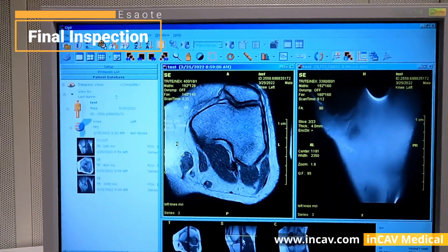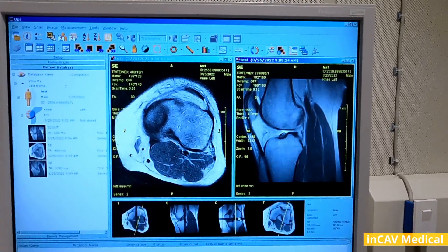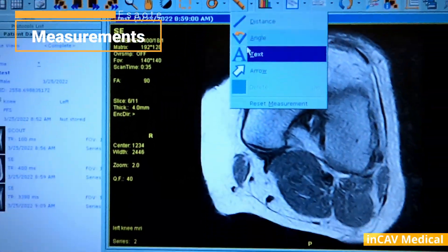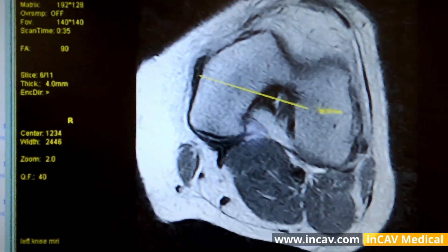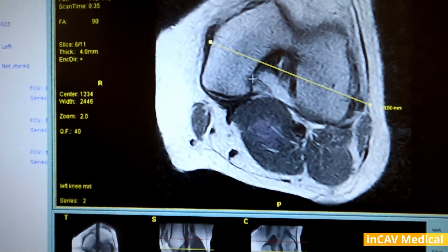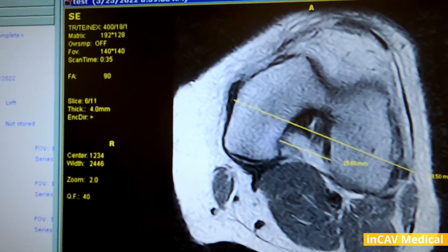With the images on the workstation, we can start reading them, write marks, take measurements, etc. The software has several tools that we can use. In this case, we are measuring the distance. Just click on the starting point and drag the line to the end point to get the distance in numbers. We can also measure angles, write text, and draw arrows.